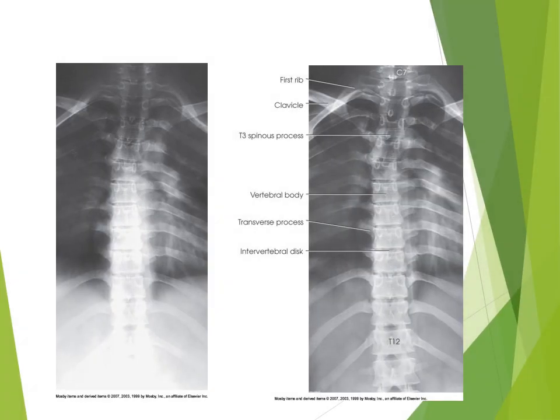And like I said, we're going to put the thicker part, which is T12, over the cathode, over the thicker part, which is fat cat. And that way we can even out the receptor exposure versus what we have on the left-hand side. So we put the cathode on the bottom and we put the anode up here. The anode is over the thinner part, the cathode over the thicker part.